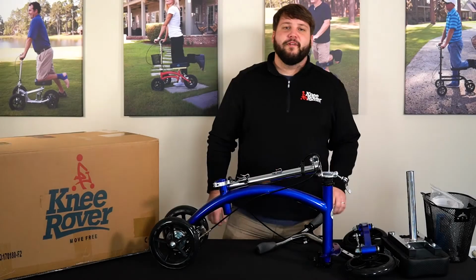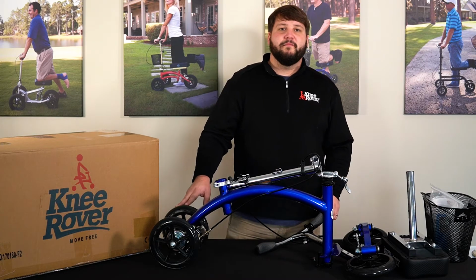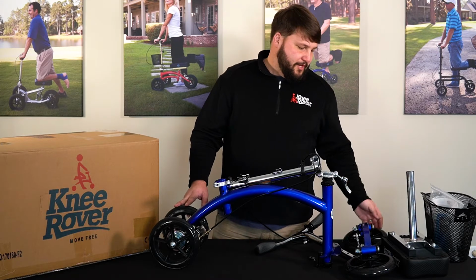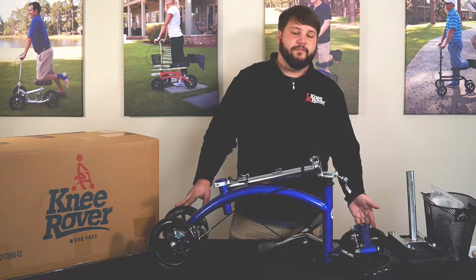Hey, Justin here from KneeRover.com, and today we're going to assemble your KneeCycle Deluxe. This is also going to be the same assembly for the KneeCycle Hybrid. The only difference is that here we have these small hard polyurethane wheels, and the hybrid model is going to have your all-terrain front wheels.